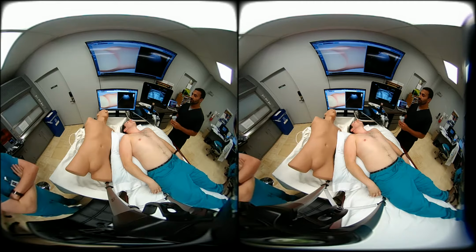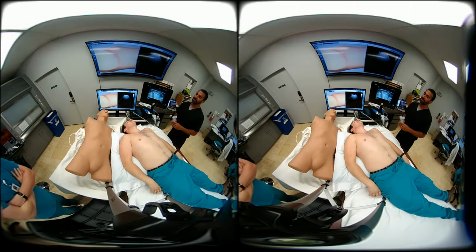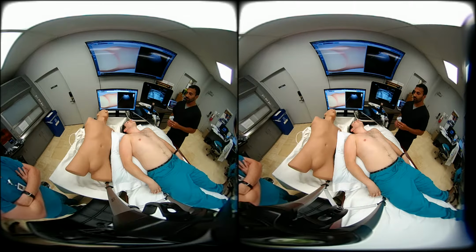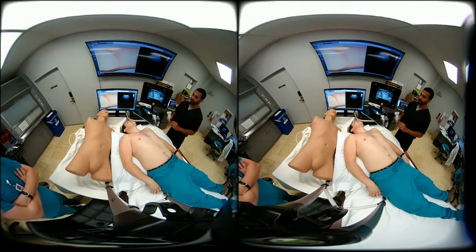Okay, for this session, we're going to look at how ultrasound can be used to evaluate the airway, and specifically looking at the trachea, the vocal cords, the cricothyroid membrane, and potentially identifying the esophagus. Since these structures are very superficial, we can use a high frequency probe. So a linear probe is the ideal probe in this examination.